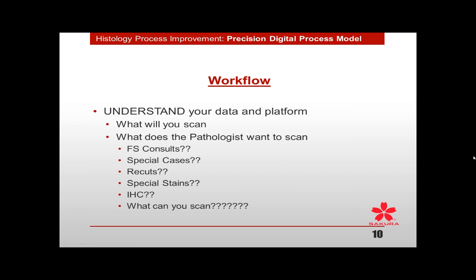What can you scan? At this point, you can't scan and put out a primary diagnosis, but even in small labs there are probably hundreds of different slides that can now be scanned to help enhance the capabilities and the performance of your pathologist. So it's very important that you start with what we are going to scan.